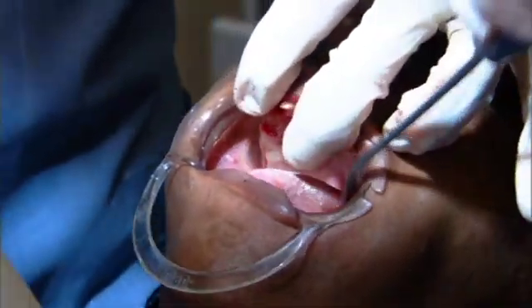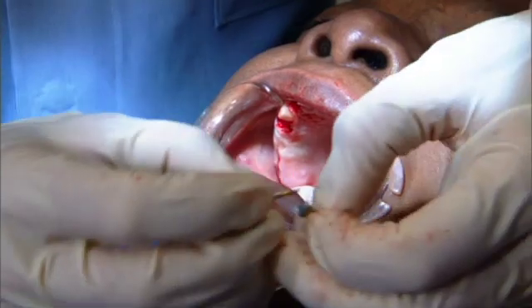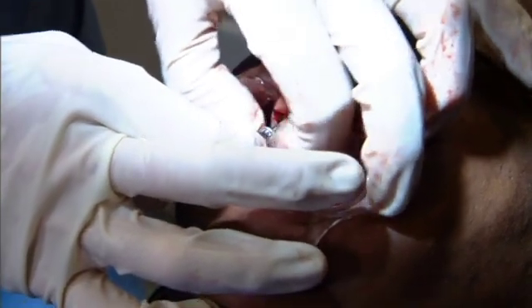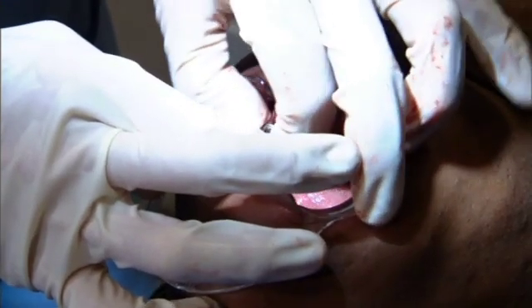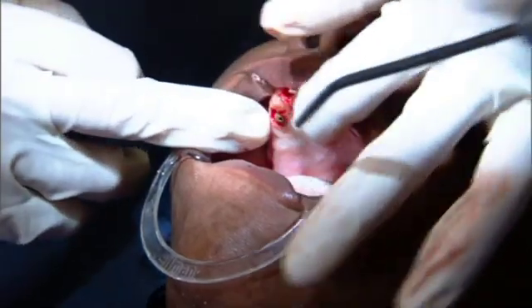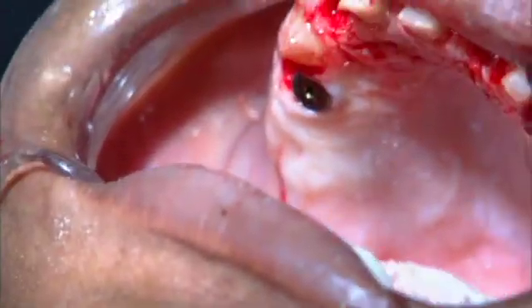Okay, let's go ahead and put on a healing cap. I've got my tri-lobe implant head in there, and on the maxilla I put my lobe to the palatal so I know I'm oriented all the time. I just finger tighten those, and I'm not going to put anything in there. We're going to let the clot fill in on the buccal. Okay, now we'll do the same thing on the other side.